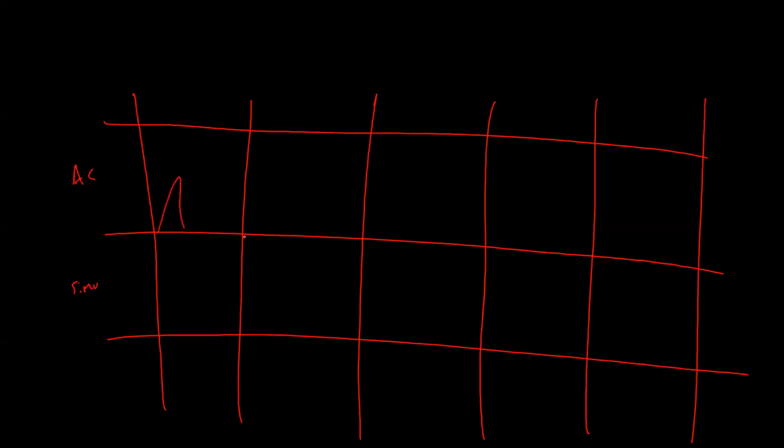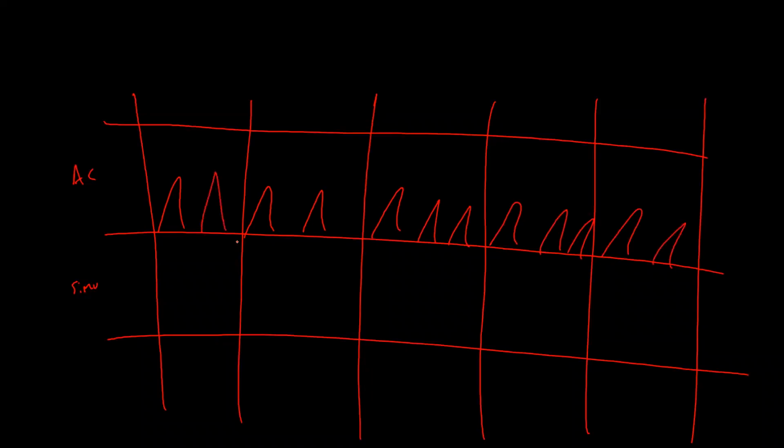Assist control, there's your breath, every window. Okay, and all your extra breaths. That's not weaning a patient. That is giving them all the support that they want.